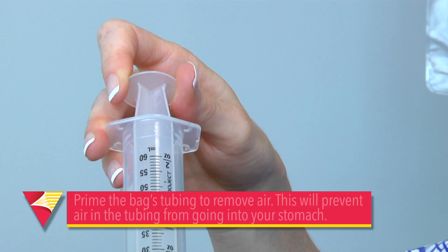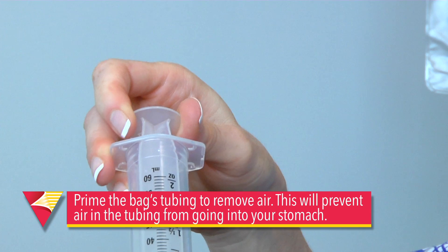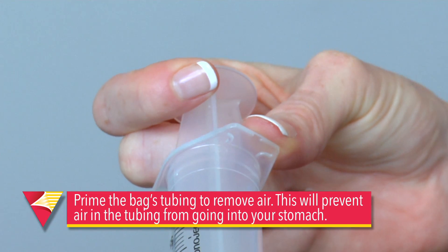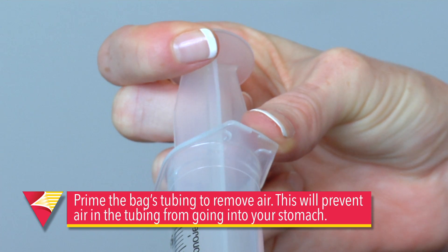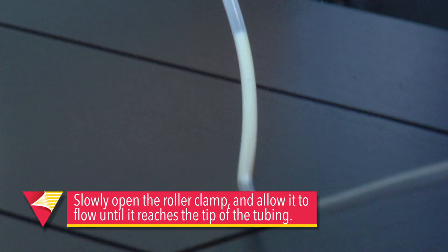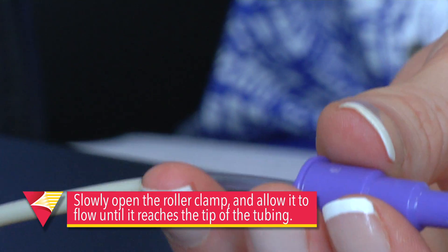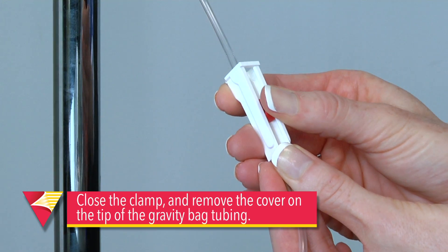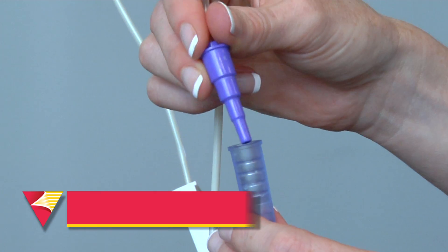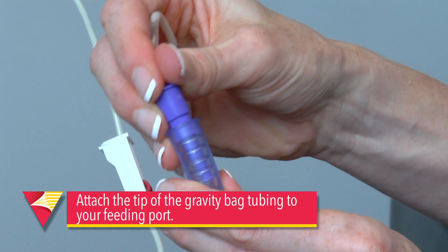The next thing we'll want to do is prime the gravity bag's tubing to remove air. This will prevent air in the tubing from going into your stomach and making you uncomfortable. Slowly open the roller clamp and allow the formula to flow until it reaches the tip of the tubing. Now close the clamp. Remove the cover on the tip of the gravity bag's tubing.